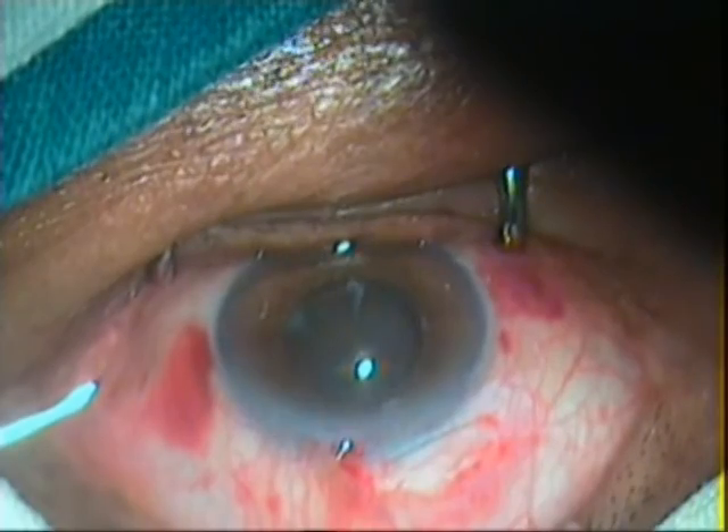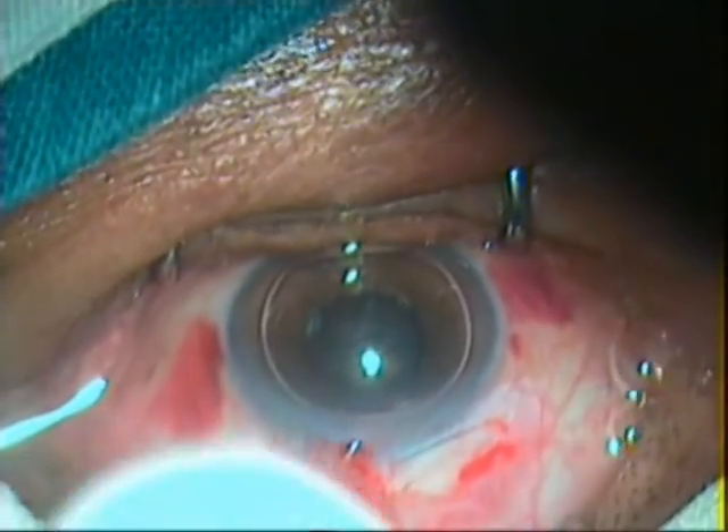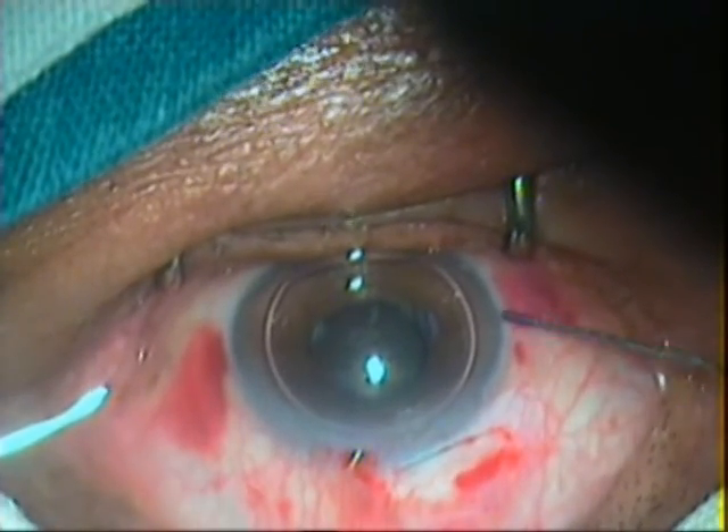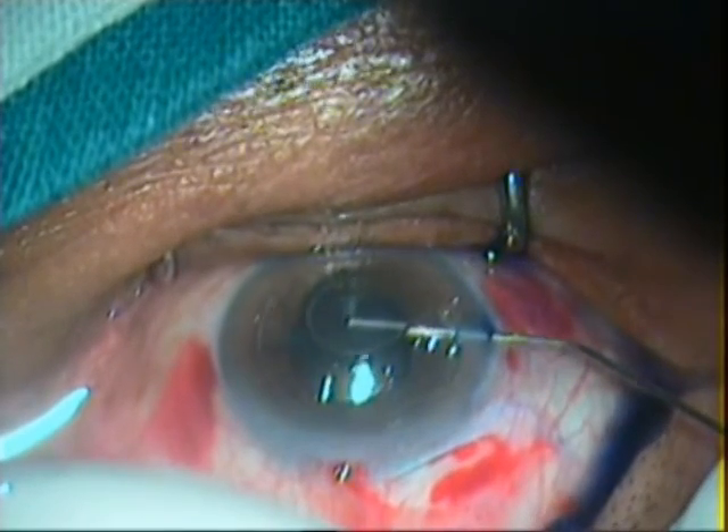Air is injected into the anterior chamber. Trypan blue dye is injected under the air bubble to stain the lens capsule. HPMC viscoelastic is injected into the anterior chamber, pushing the dye and air out.